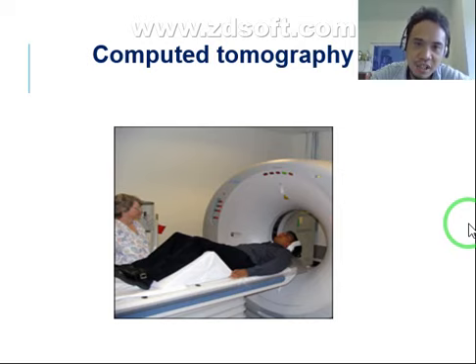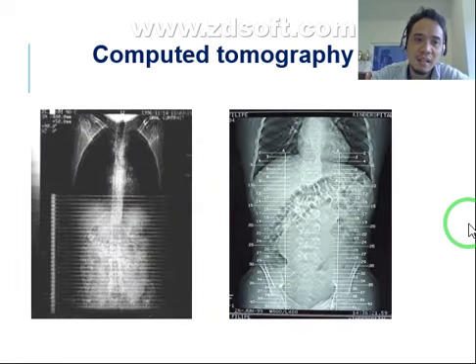So this is the position of the patient in abdominal scan. So pwede siya head first, pwede po siya feet first. Okay? But we prefer nga naka-feet first ang pasyente. Okay? Para mas dali ba? Okay? Mas duol. So this is the scanogram. Naka-AP projection siya with the grid lines.